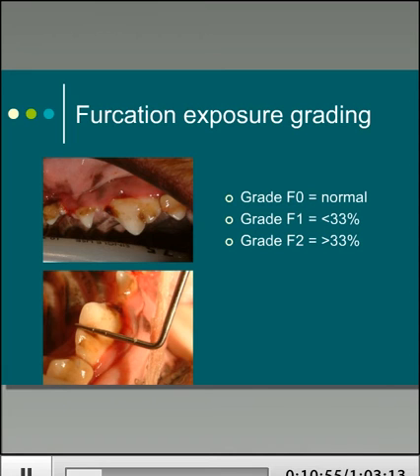Bear in mind, however, that the gingival margin might not have altered much. So sometimes, although the probe would pass from either side, the gingiva kind of masks that, and that's what you're looking to investigate around, the bone loss that we're looking at. Gingival margin, as I say, might still be at the same height, so don't be fooled by that.